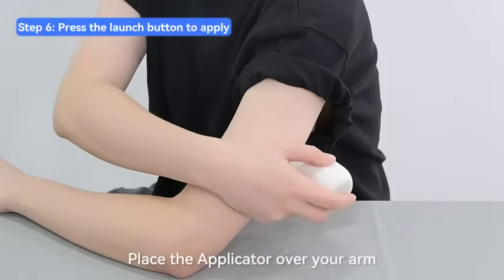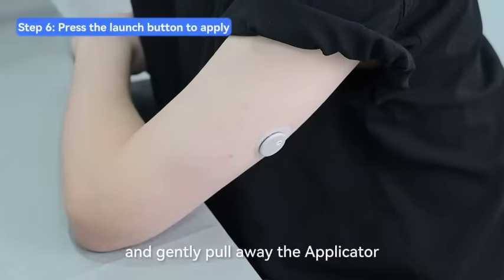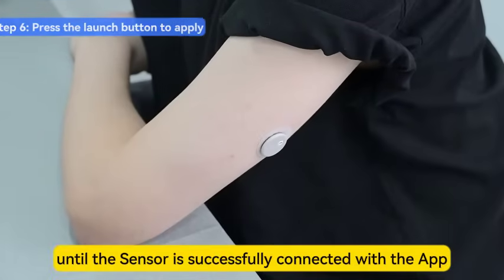Place the applicator over your arm. Press the gray launch button on the top and gently pull away the applicator. Do not discard the applicator until the sensor is successfully connected with the app.